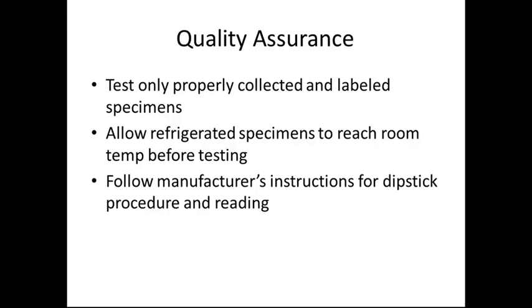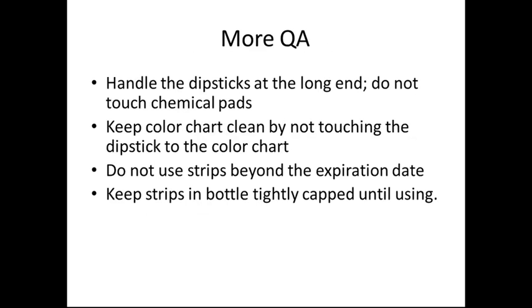Follow manufacturer's instructions for dipstick procedures and readings, which we just went over. Handle the dipsticks at the long end. Do not touch the chemical pads. It's important because if you touch the chemical pads, it can alter the results of the test, due to maybe a chemical reaction on your glove or your finger. Keep the color chart clean and not touching the dipsticks.